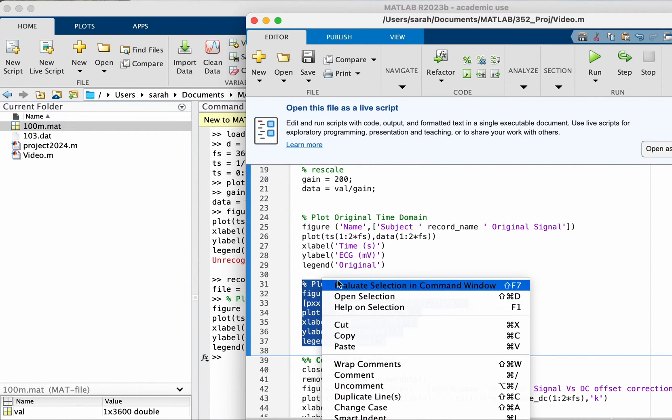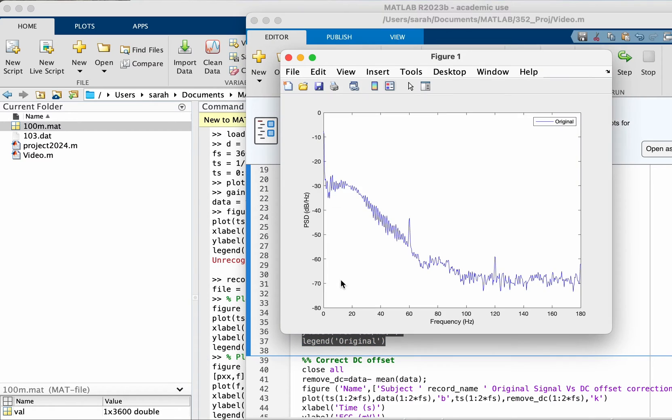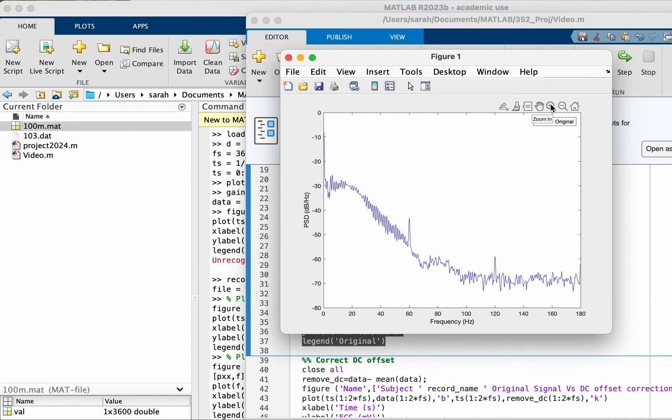Let's move on. Now we plotted it in the time domain, let's actually look at it in the frequency domain. If you look at it in the frequency domain you can spot a few issues.